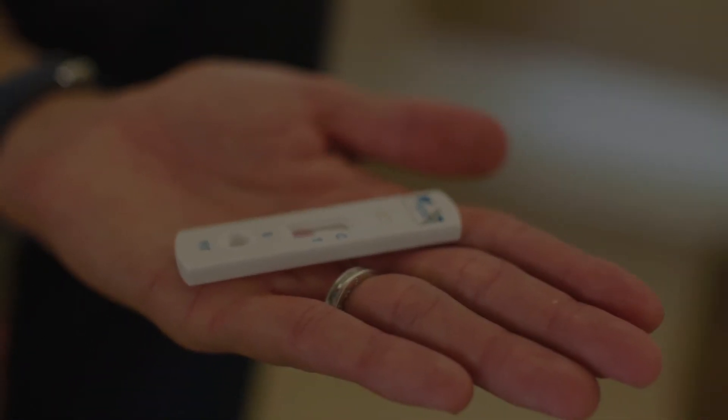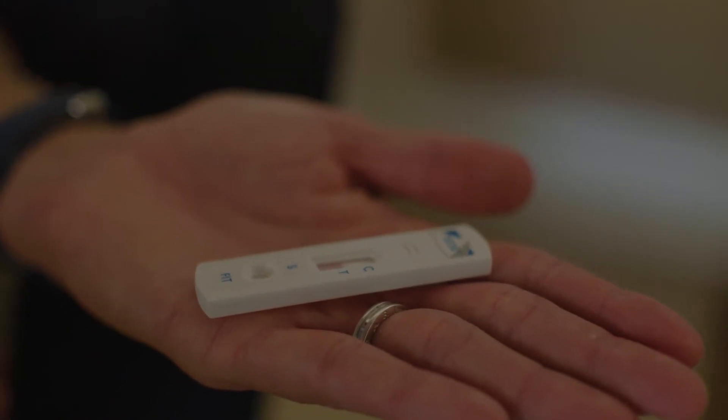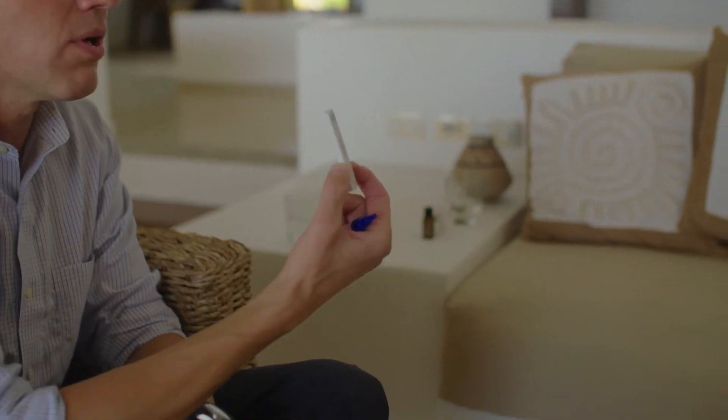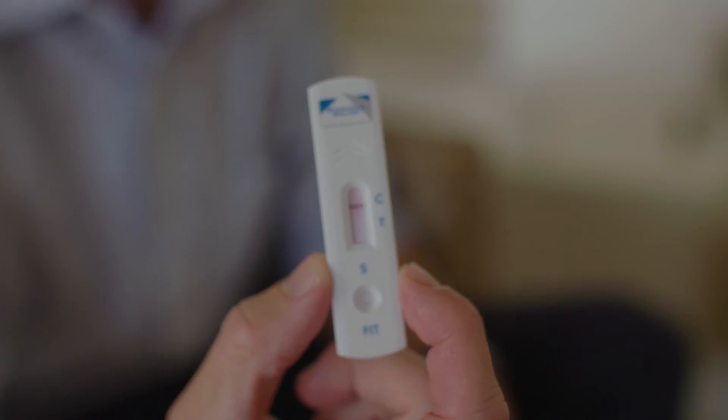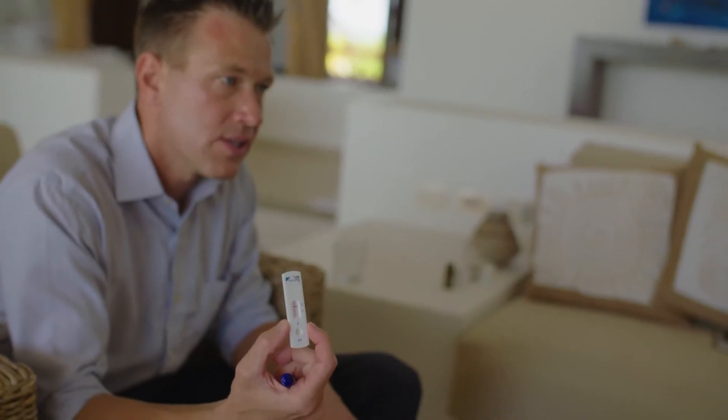The important thing to know is that one line is negative and two lines is positive. Negative is good; positive means go get a colonoscopy. It's quite simple and very clear — this is what a negative result looks like, and a positive result would look like that with two lines.